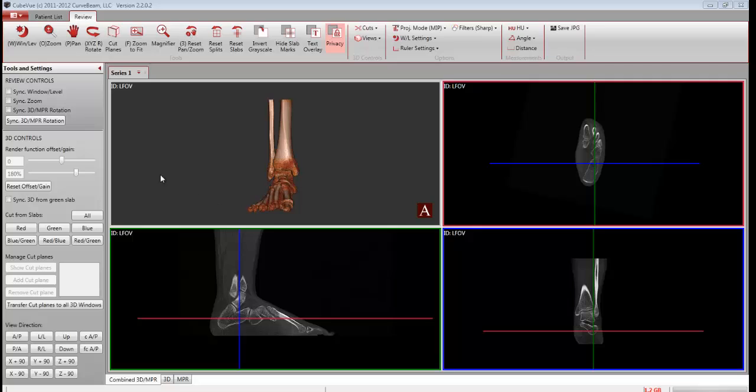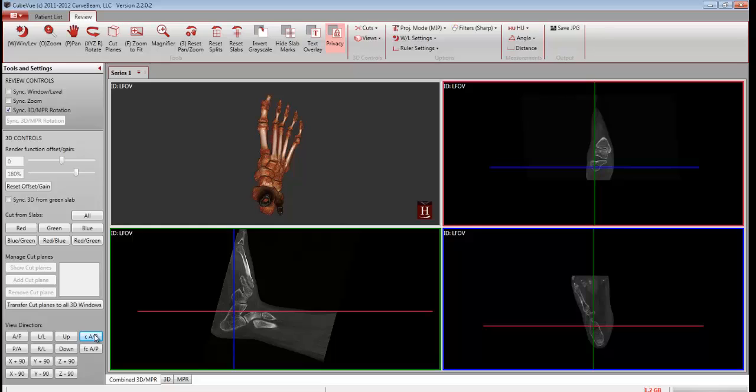First, click on Sync 3D MPR Rotation. Next, click on View Direction of CAP.